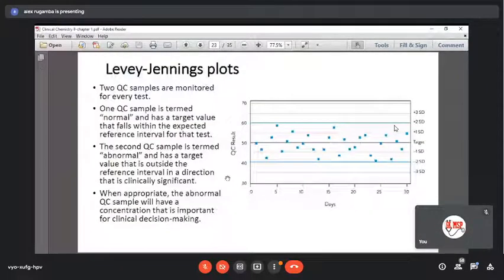So that's quality control. I told you about daily quality control, writing the results that you get somewhere. For example, today I got 70, tomorrow I get 71, Sunday I will get 75. Then you take all those results and plot them on a graph. This graph is called the Levey-Jennings plot or Levey-Jennings curve. So you see, this is the mean, like a target, and then you plot your samples here. If it is a negative control, for example for blood sugar, it is here to be 70.